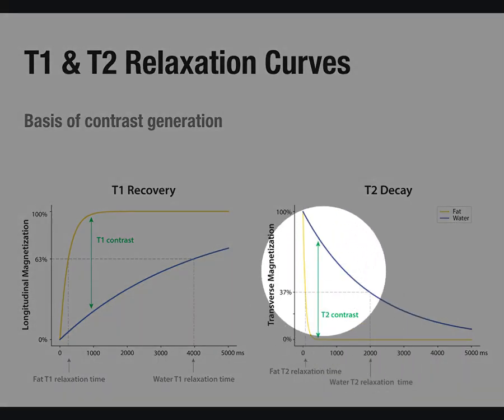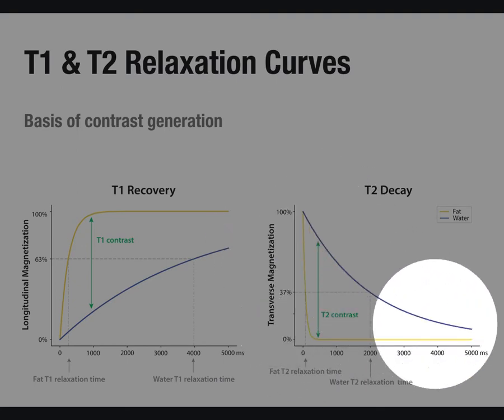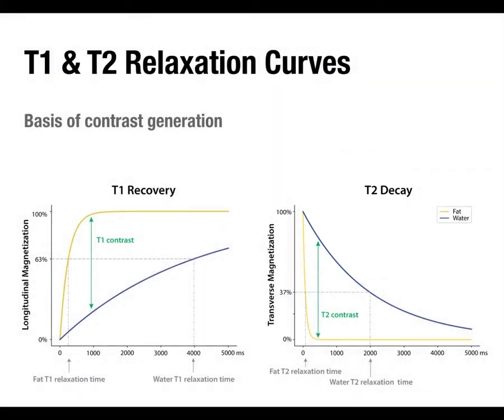And again, the T2 decay time for fat is much faster than the T2 decay time for water. There's a couple of reasons for that, and basically it has to do with the fact that you're sending energy into these protons, they're absorbing it. Both of these phenomena have to do with how quickly those protons lose the energy. The way they lose the energy is transferring it to other things around them in what we call the molecular lattice.